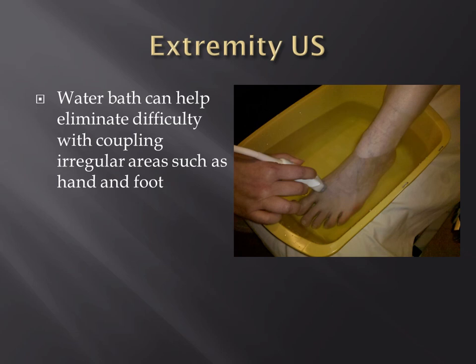You know that because you can put it in various parts of the body and sterilize it afterwards without risking any contamination within the transducer itself. So they generally do just fine in this water bath. And I found this pretty beneficial, especially when you're looking for foreign bodies in the hands or the fingers, especially in kids when it's been in there for a while. It's extremely painful, and they don't want any pressure from a transducer.